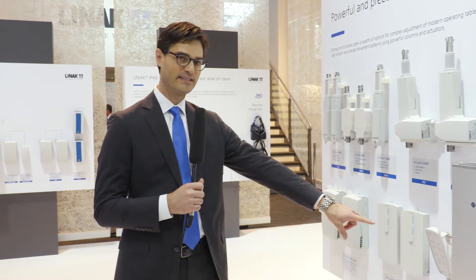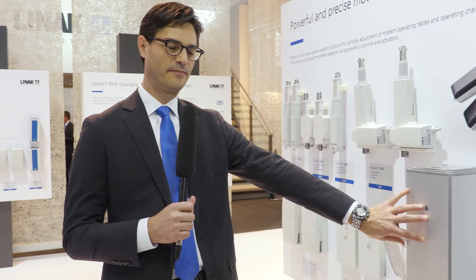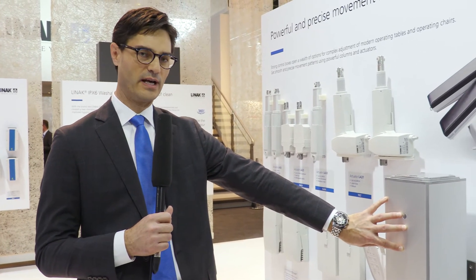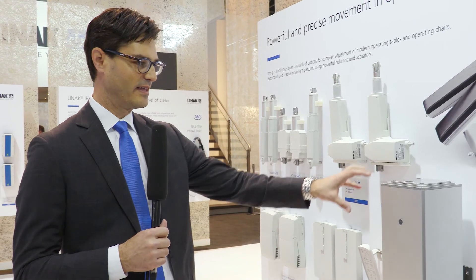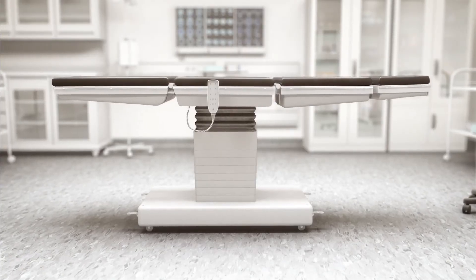It is connected to two batteries and the main high-low lift is provided with our new LC3 lifting column. This lifting column is three stages and it's very fast and very strong.